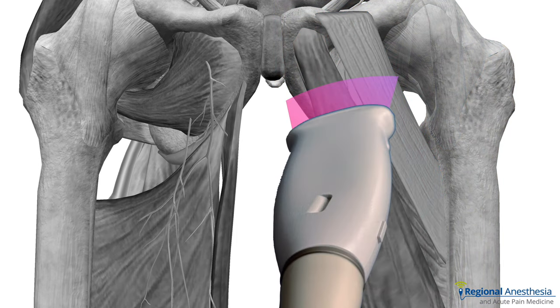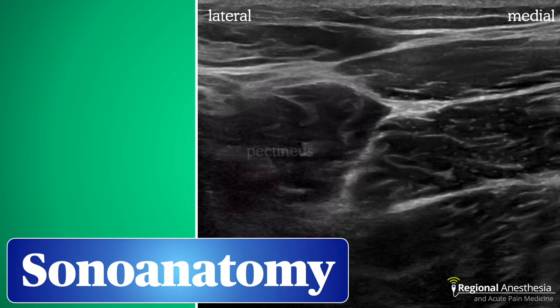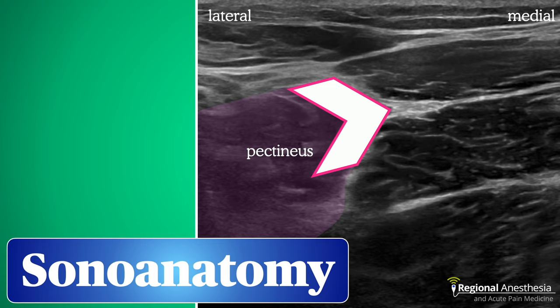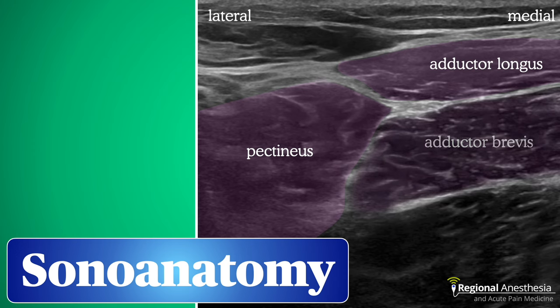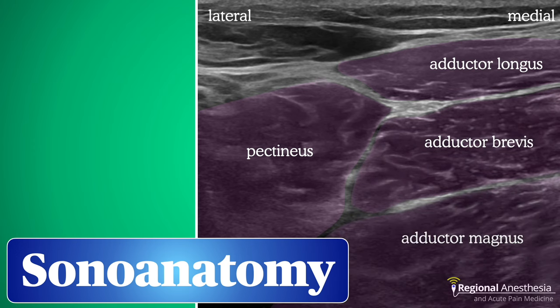If we put a linear ultrasound probe in the inguinal crease and scan medial to the femoral vessels, this is what we'd see. We have pectineus laterally with its characteristic chevron shape to its medial edge. Then we have a three-layer sandwich medial to that: adductor longus, brevis, and magnus. You can see nice clear fascial planes between them.